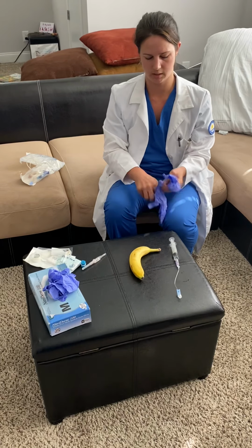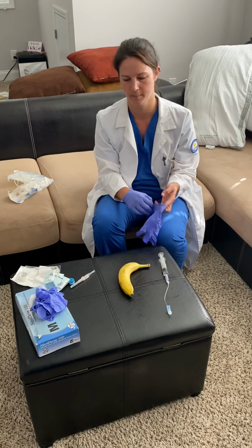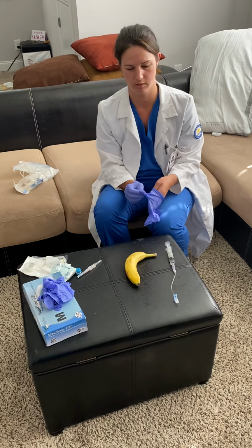And you want to make sure that when you're choosing an arm, that you're not choosing one that has any comorbidities. Making sure that you're choosing the non-dominant hand, making sure that it wasn't a previous arm that has some infiltration used or anything like that, or infiltration happening, and that there's no open wounds or anything. And I'm going to be using the basilic vein on the patient, and we're going to be using their right forearm.